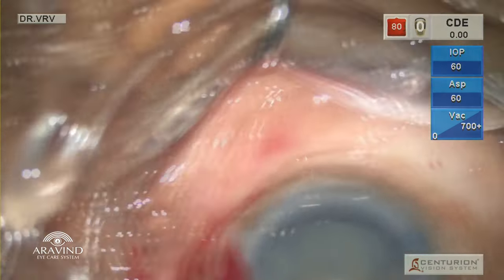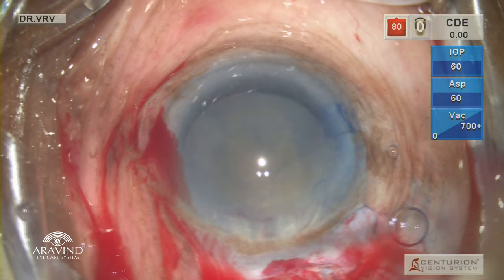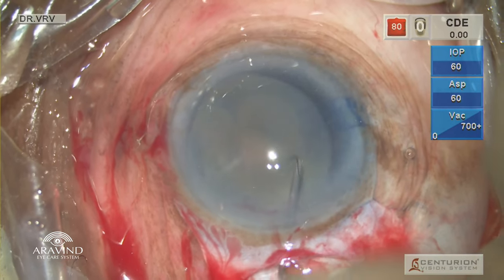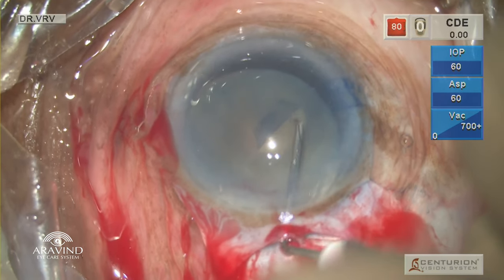Ideally, you should be using a capsulorhexis forceps to complete the rhexis. In this video, I am going to show you how to use a cystitome in such cases when there is no availability of rhexis forceps. Initiate a flap wherever the tear is. Here, inferior flap is initiated.